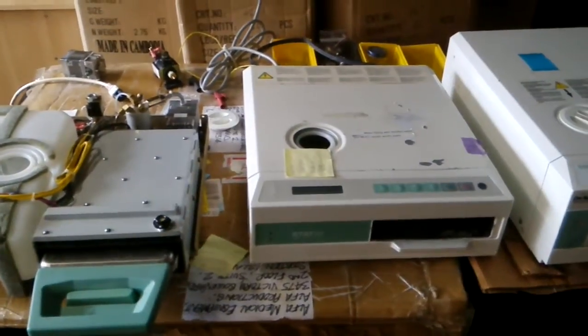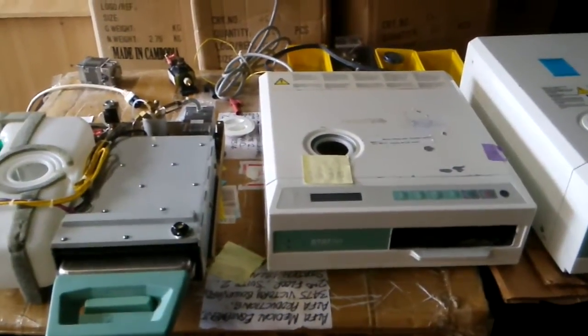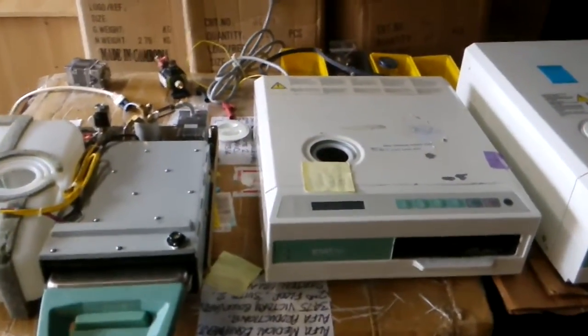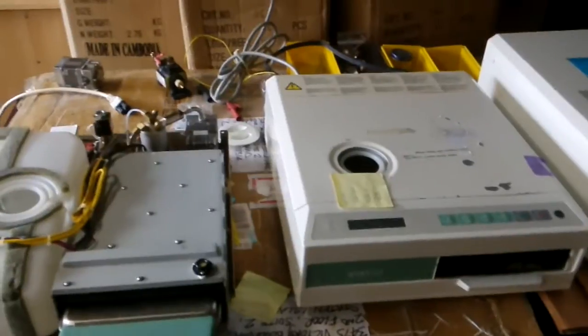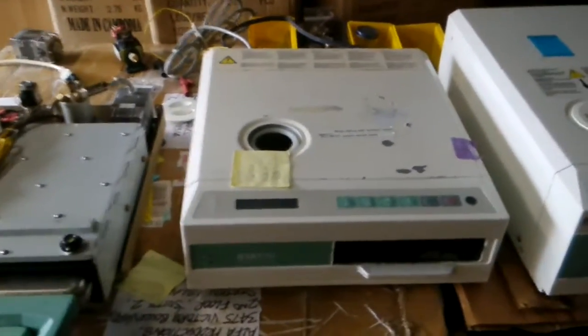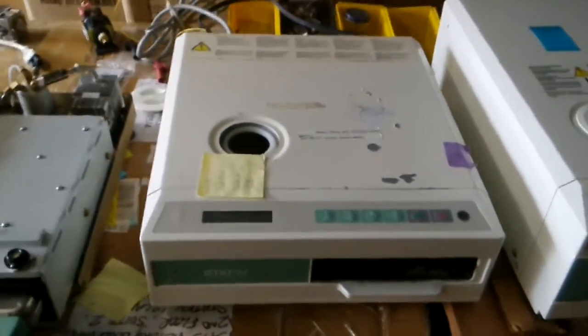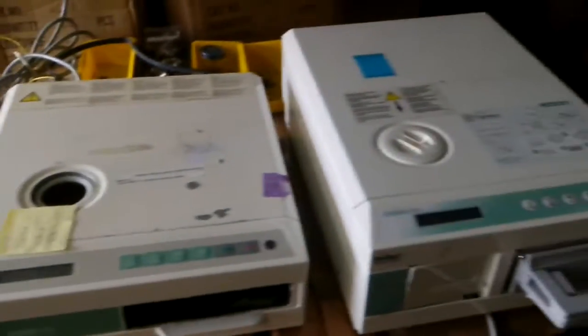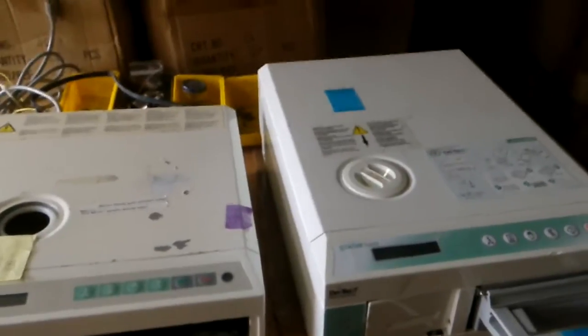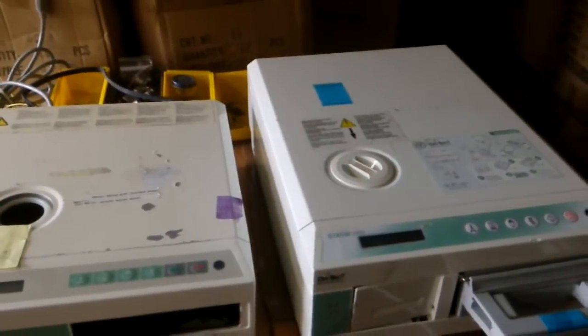Today we will show you how to repair Statin sterilizers: Statin 2000 and Statin 5000. Statin 2000 is a little bit smaller, while Statin 5000 is bigger and comes with a printer in the front side.